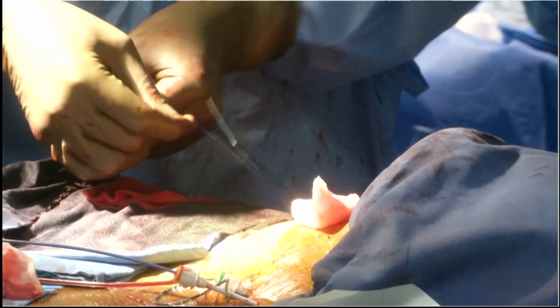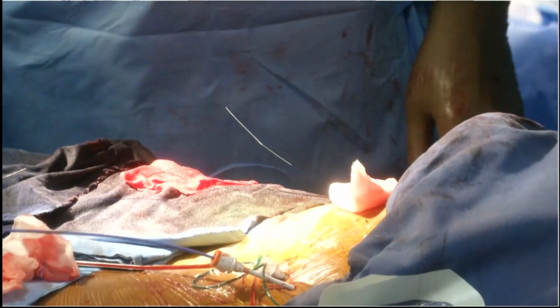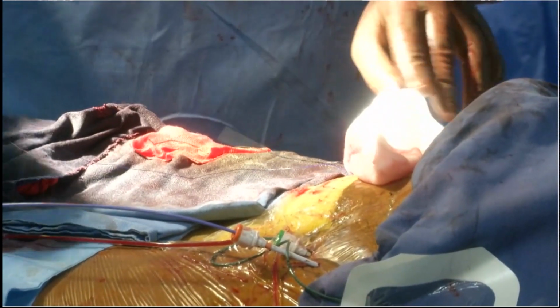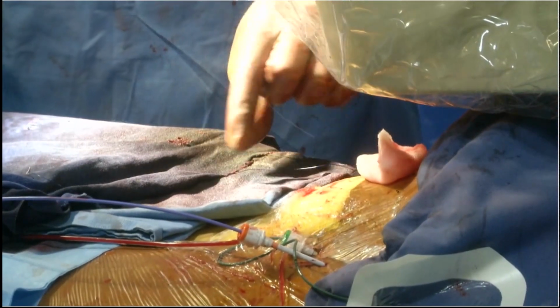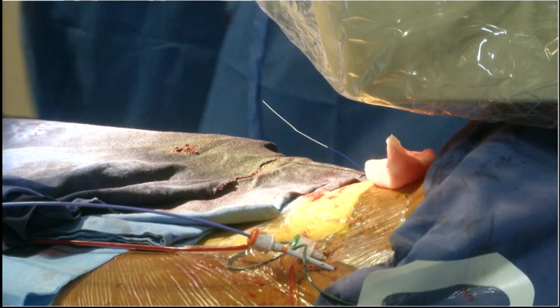what we do is, after two ProGlides, if there is a big ooze, then we put a 6 French sheath. If the 6 French sheath stops the leak, then we use the Angio-Seal. Otherwise, a third ProGlide. I think what we have done here is just one ProGlide, not the other one yet. We wanted to check and see, and maybe he will just leave with one ProGlide.